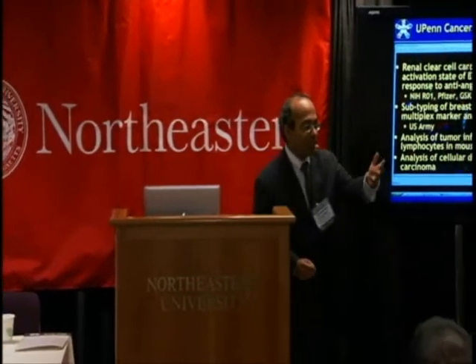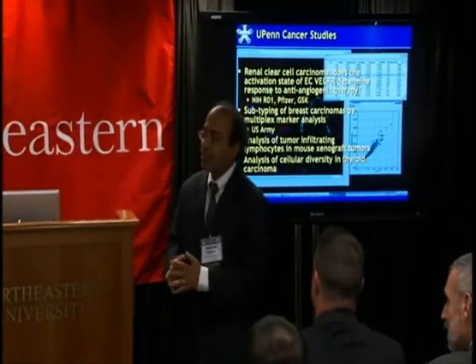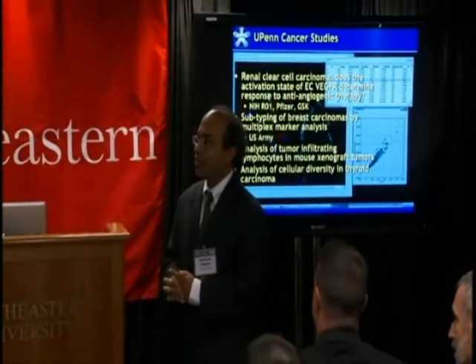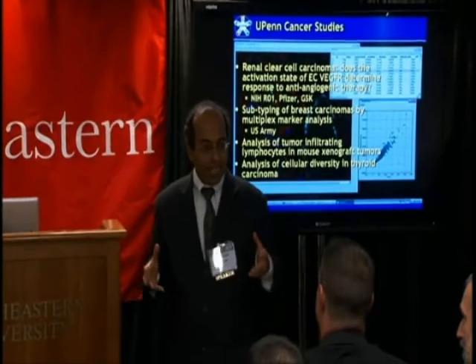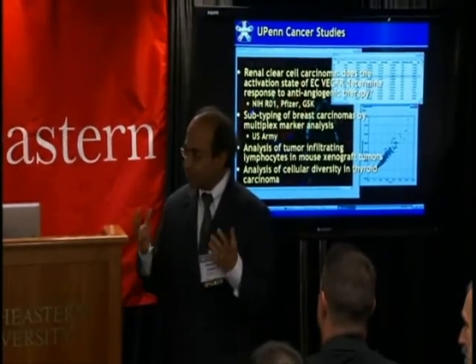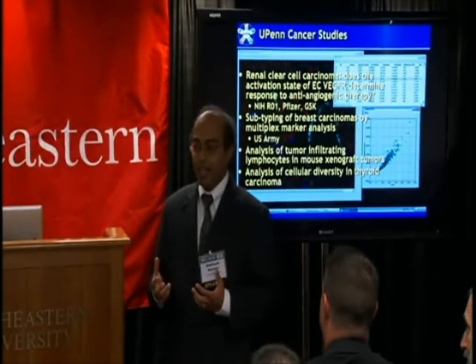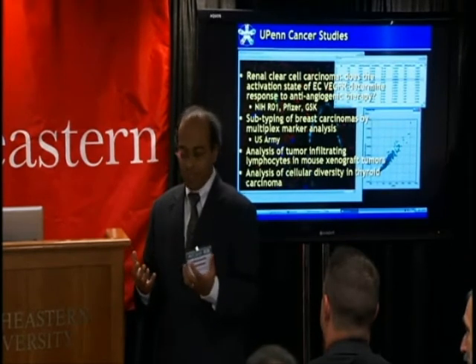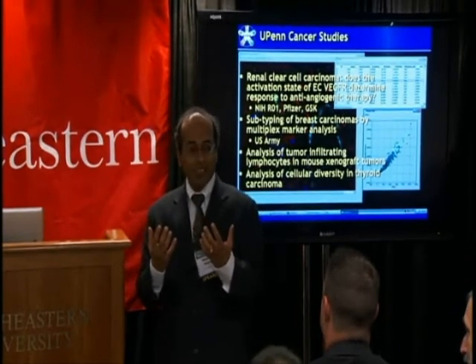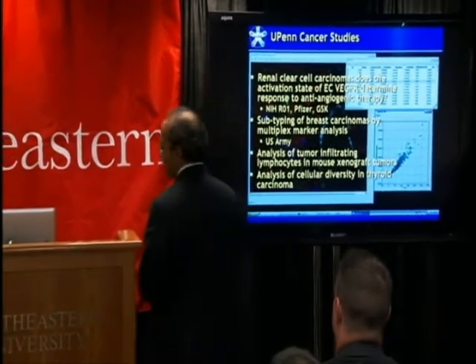And one reason why it happened is that some of my students, people like Kedar and Yusuf and Raghav, sat there and did something that we academics are not comfortable doing. They actually built a software system that works. They actually debugged it, and it actually works, right? It has visualization, a GUI, it has database linkage, it has everything. And it's free now. There's no barrier to adoption. So Issei Kumiko could simply sit there at the back of the seminar room, download it, and run it. And before long, we have fresh publications coming out of this.